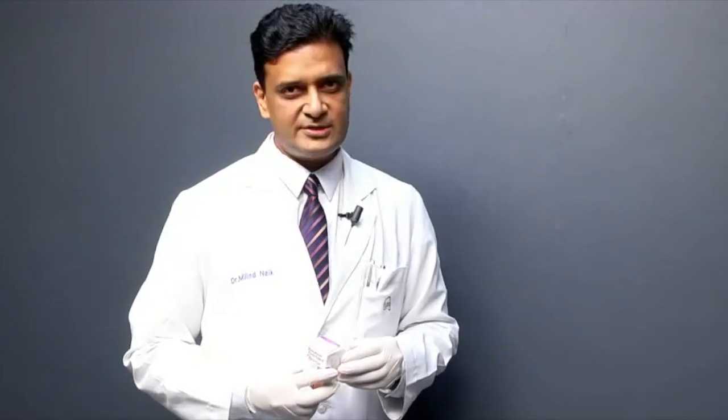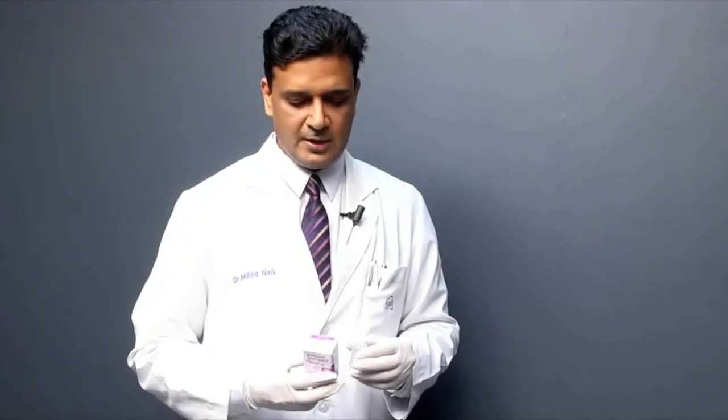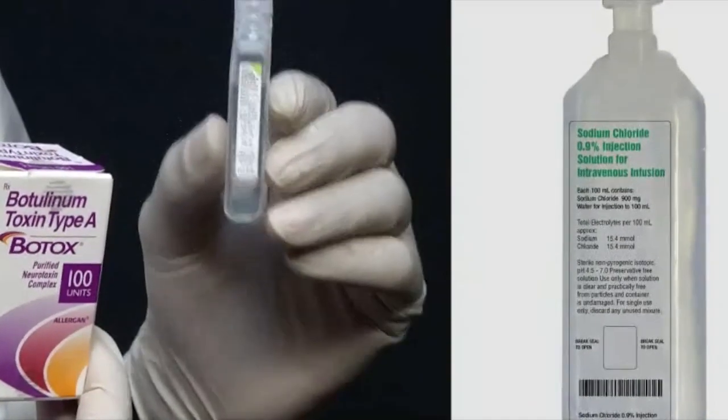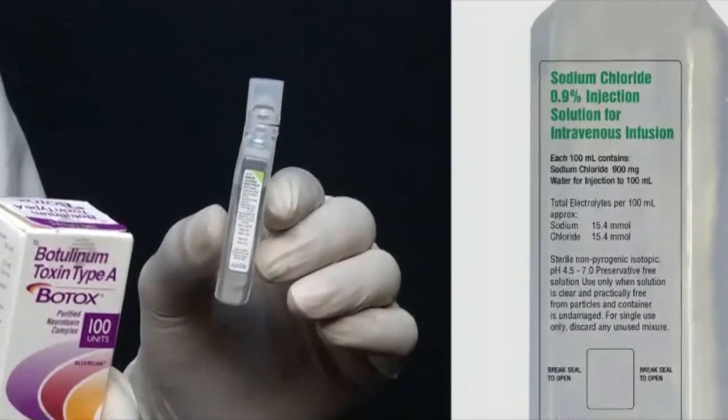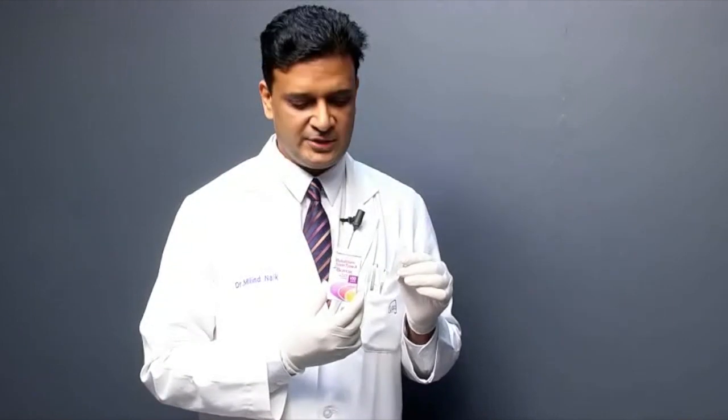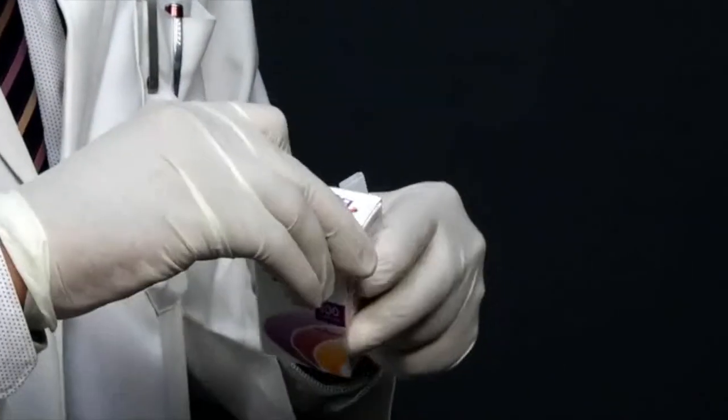Now we are going to look at how to reconstitute botulinum toxin. Here I have a 100 unit vial of Botox, and we also have preservative-free 0.9 percent normal saline. These are the two things required to do the reconstitution. We will now open up the 100 unit vial.